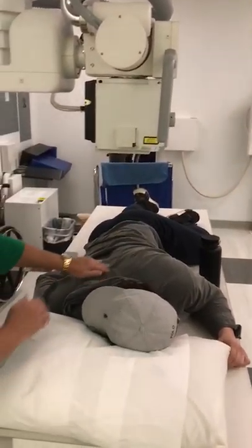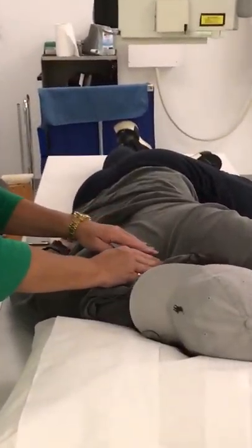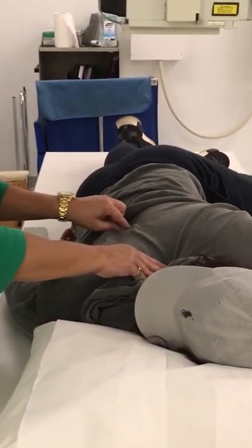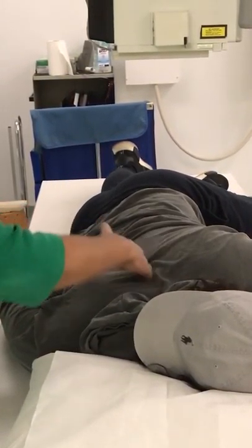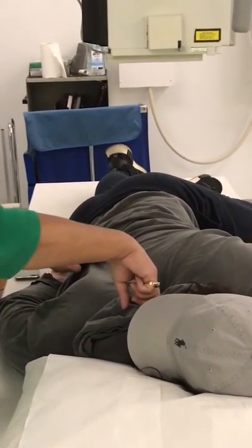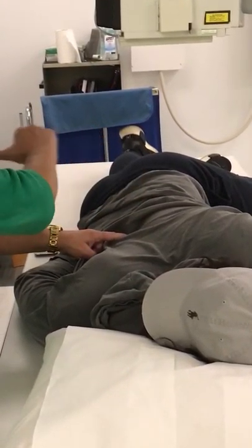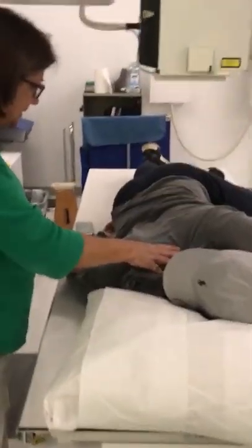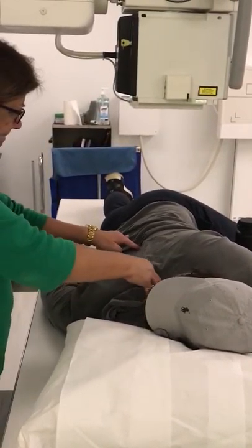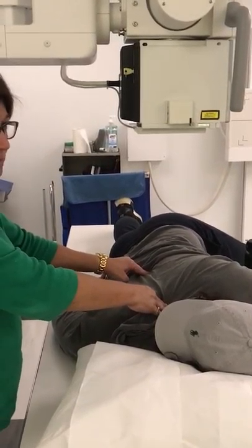You still want him straight on the table because remember your esophagus is about a 10-inch long tube, and you have to make sure that on your image you get that area where the esophagus meets the stomach. So he's not straight on the table. His esophagus starts here, and by the time it reaches the stomach, it's over toward this side of the table. So, sir, I just want you to scoot your hips forward on the table. And you can judge that by palpating the spine.